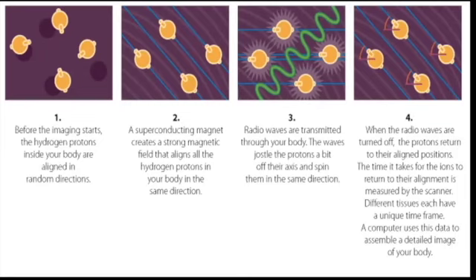Now, I know the physics is complex because MRI physics is a full subject on its own. So definitely this is just a very simplistic overview. However, if you understand that this relies on hydrogen protons, and that the MRI is a big magnet that sends a radio wave and then shuts it down, and the computer uses the information to create an image, then you're good to go.